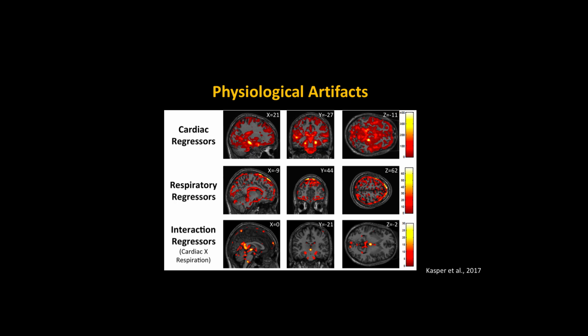So the fMRI lab, I'm not sure if everyone knows it, but this is Scott. Lab records physio, by and large, unless you don't want it, and then implement it in the data. That's more of a study-by-study choice. Some people do use our physio correction, so we do that stage of processing. Others don't, but they still get the physio traces and have them in case they ever want to use them.